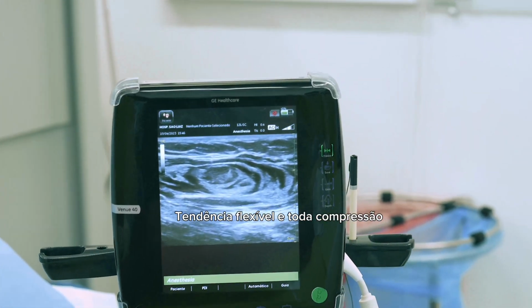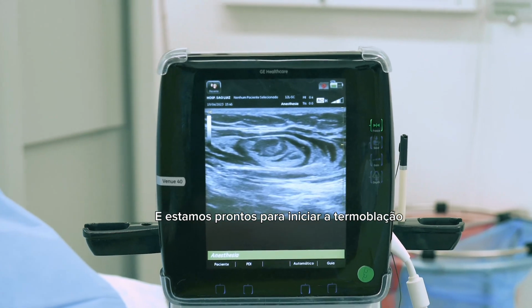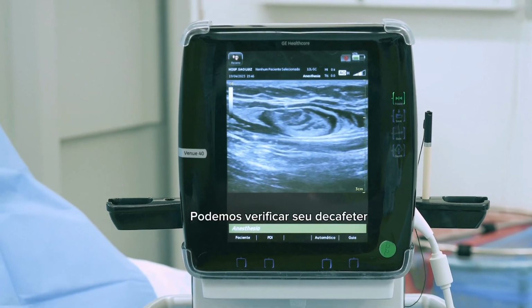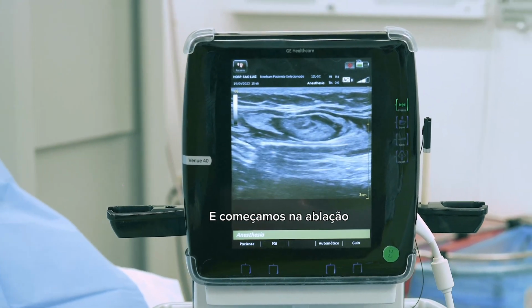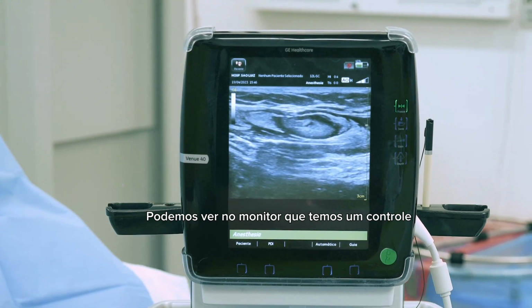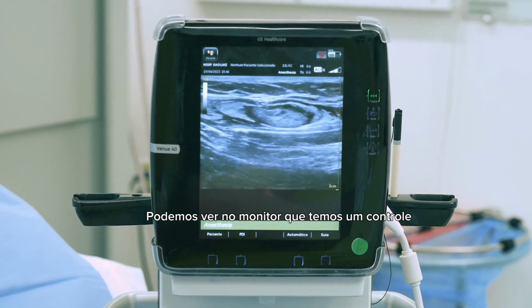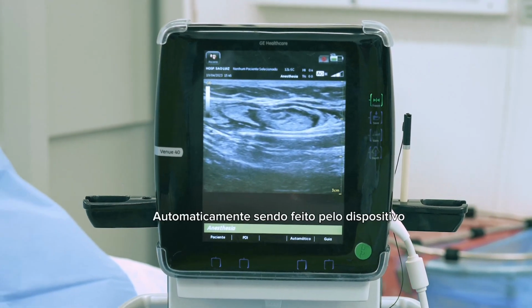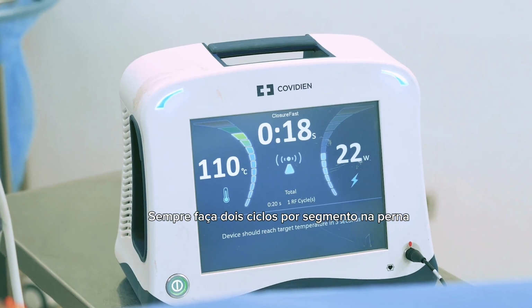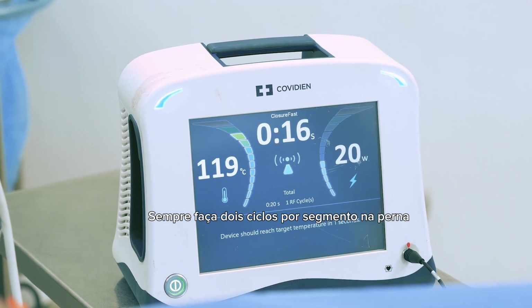Trendelenburg and now compression, and we are ready to start the thermal ablation. Go on, please. We can check the catheter there, and we start the ablation. To do the ablation, we can see on the monitor that we have automatic temperature control by the device. We always do 2 cycles per segment in the leg.